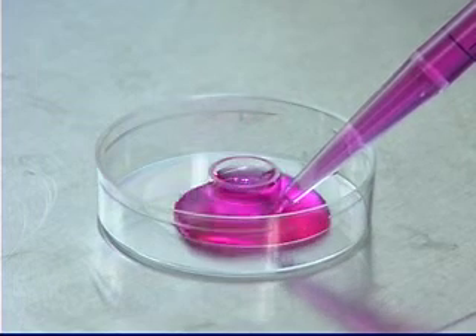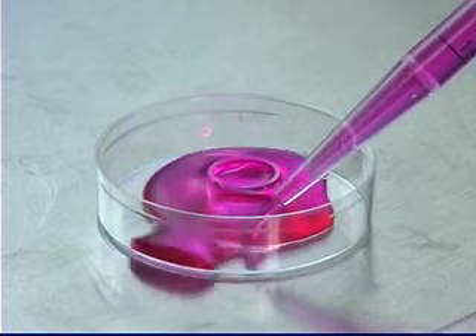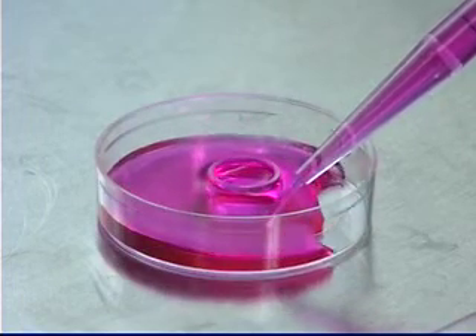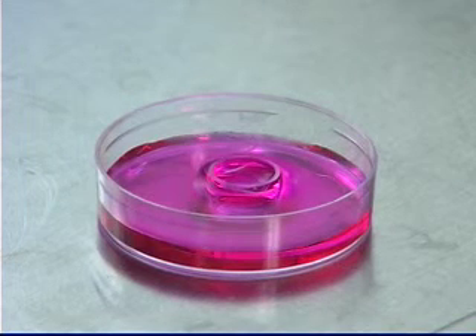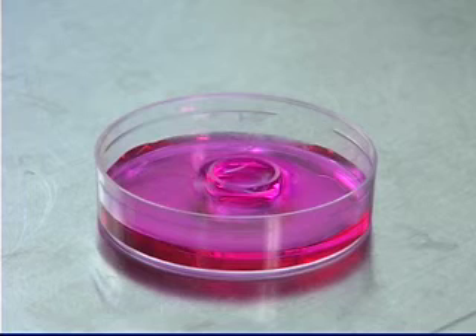Culture cylinders are made of autoclavable glass and have a specific gravity of 2.55, so they won't float around like plastic cloning rings. They are available in a variety of sizes from 1 to 14mm inside diameter.